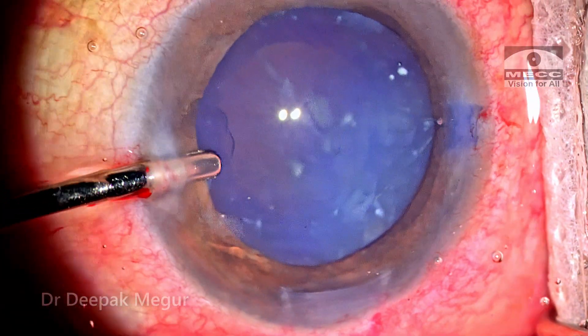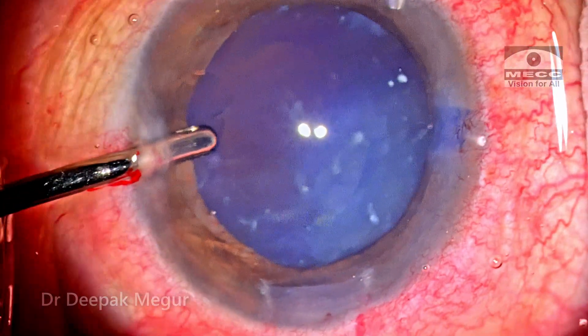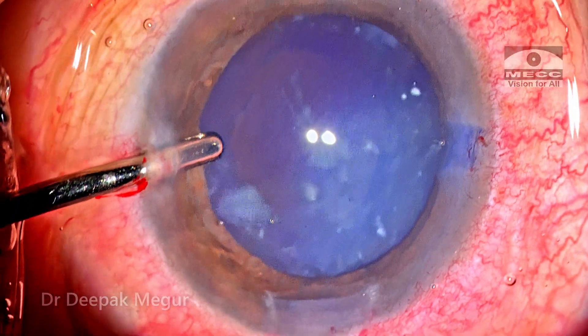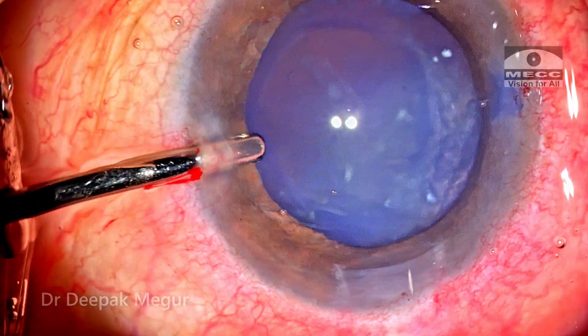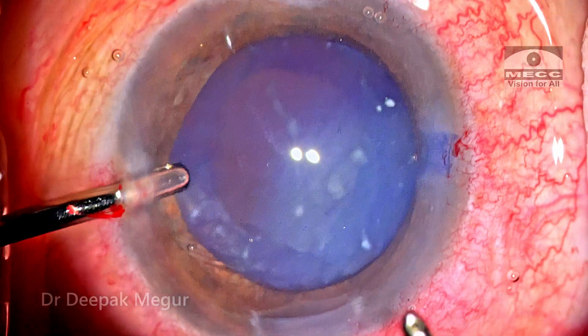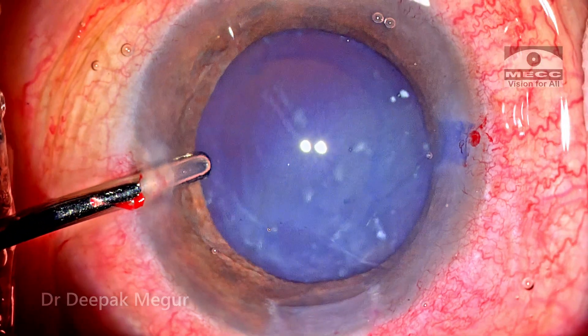In long-standing cases, the lens matter finds its way both through the anterior capsule as well as the posterior capsule. There is a notable lack of the red glow — the obvious reason is that the liquefied cortex has escaped or diffused across the posterior capsule into the Berger's space.